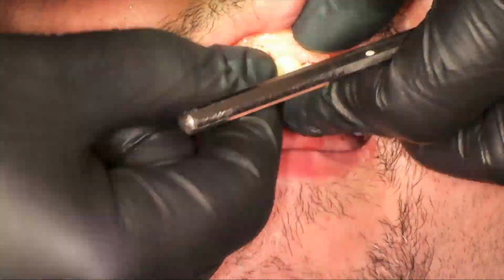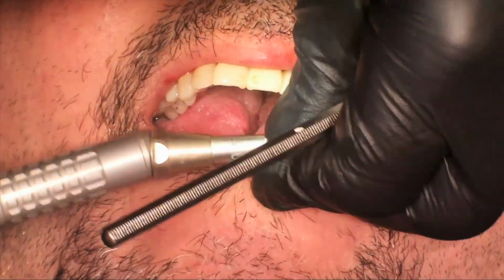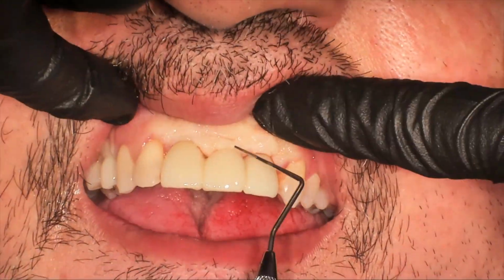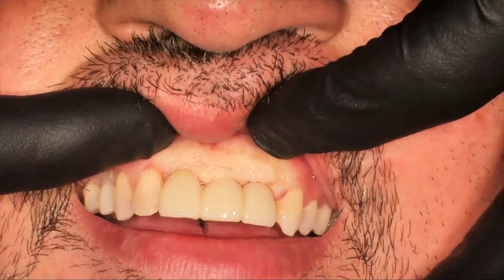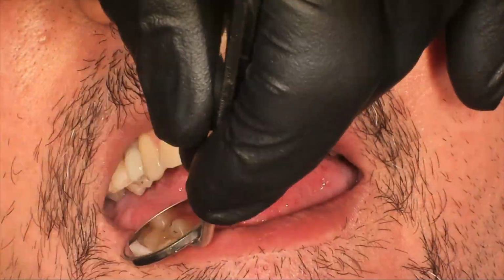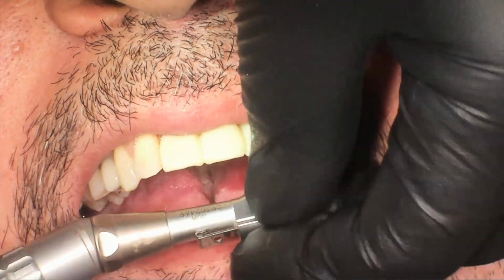So we're going to remove the healing abutments. Now we can get our implants down, but we're still getting pressure in the site number 9 for the Pontic area. So now we're going to go ahead and use a burr to adjust that area. So let's go ahead and tighten the implant in site number 4, and then we're going to unscrew the anterior bridge. And here we're putting Teflon tape and composite in number 4 so we can get that finished up, and then we can focus on this.